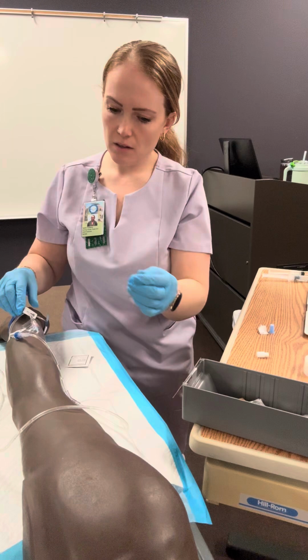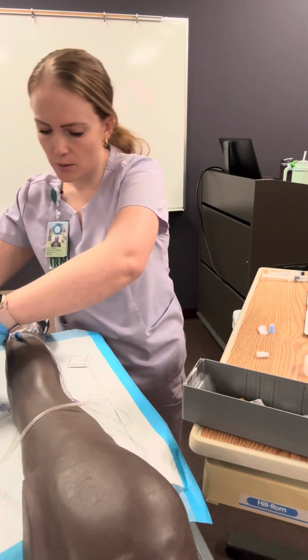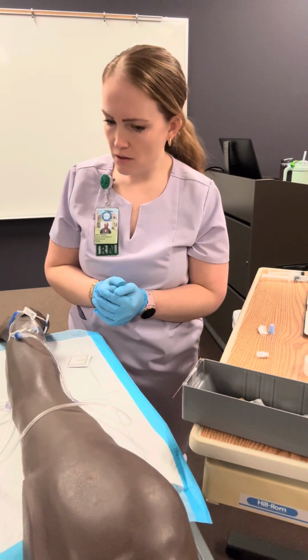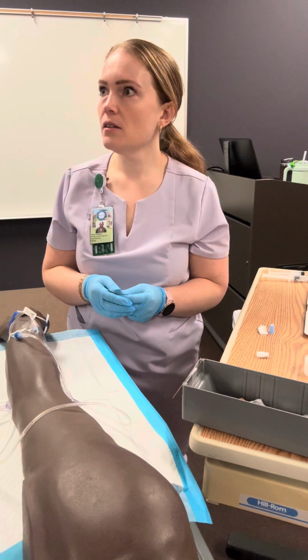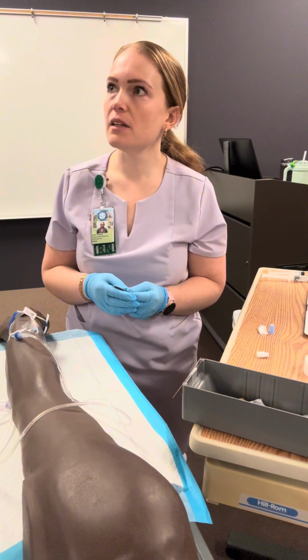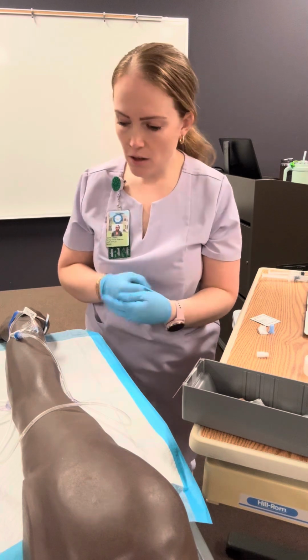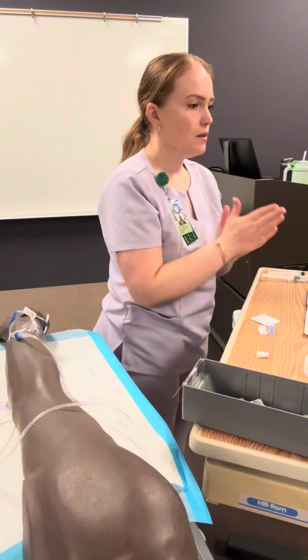I'm going to unclamp here. I'm going to unclamp in the two other spots. I'm going to make sure that it is dripping. I'm going to be assessing to make sure that there's no signs of infiltration or inflammation. Do you feel okay, Miss Brown? Perfect. It is flowing. It is going at the rate of 100 mils per hour, and so with a bag of 50 milliliters, this should be done in 30 minutes. So I'll be back in 30 minutes to check on you. If you need anything, please let me know. I'm going to remove my gloves, perform hand hygiene, and document my findings.